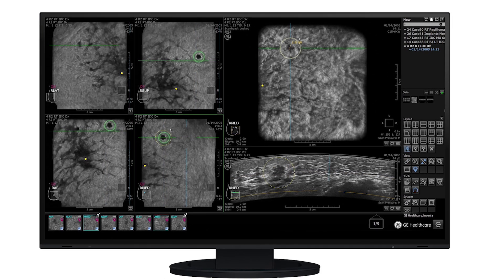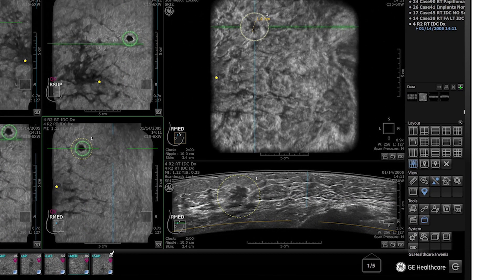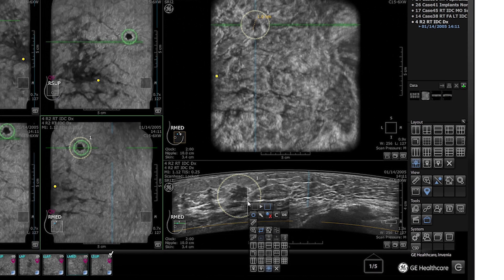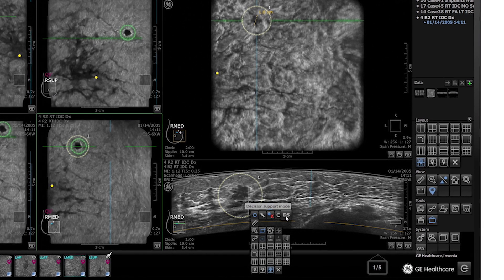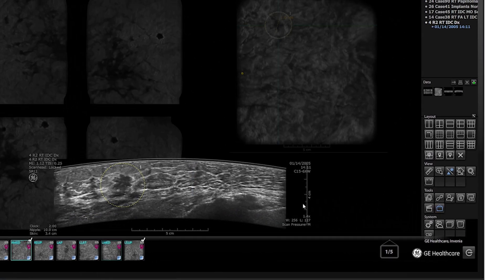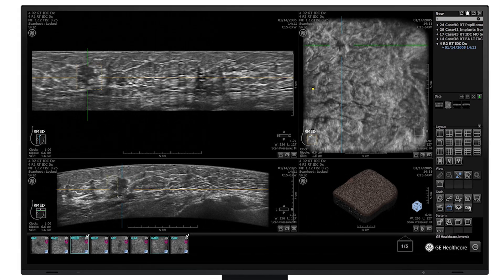In this case, QView CAD has identified a suspicious area that needs further review. By activating Kios DS Breast, the user can access the probability of malignancy.